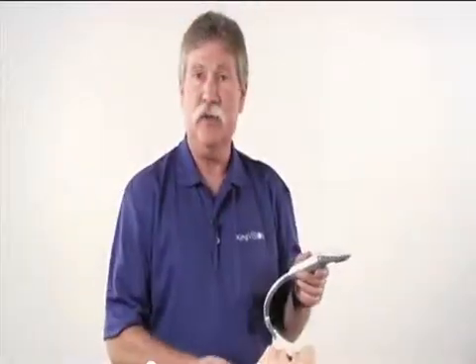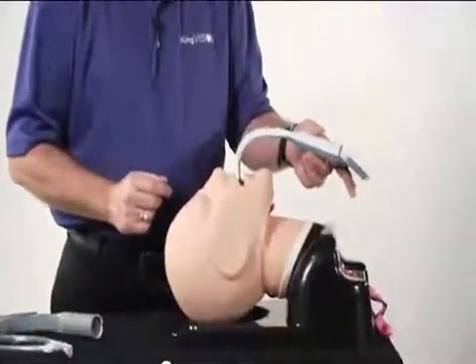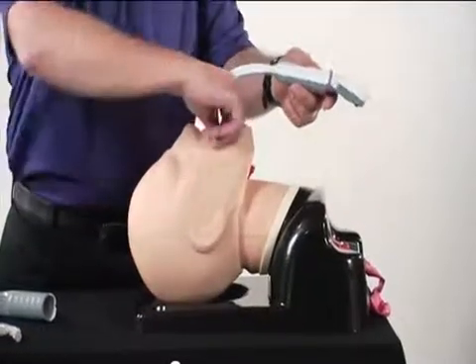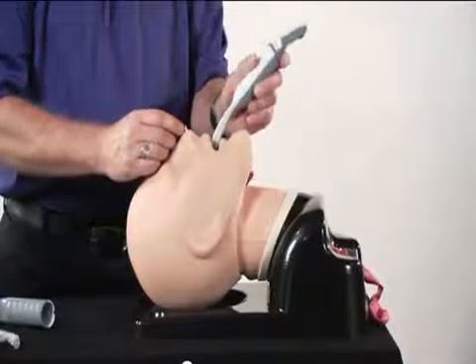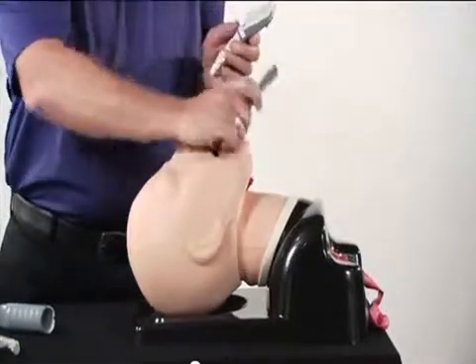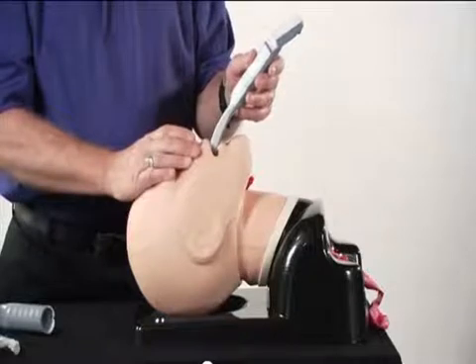In introducing the King Vision video laryngoscope blade into the mouth, there is sometimes difficulty with someone with a large chest, that the screen may contact the chest. So there's several things you can do. Obviously, if you can open the mouth a little bit wider, follow the base of the tongue, you can also rotate in from the side, or in extreme situations, you can actually introduce the blade first, then attach the display before powering up and visualizing the vocal cords.